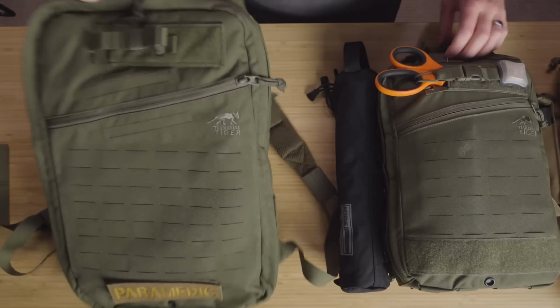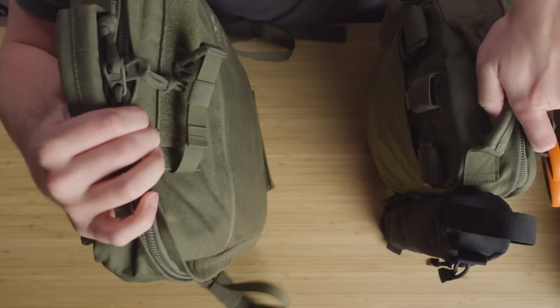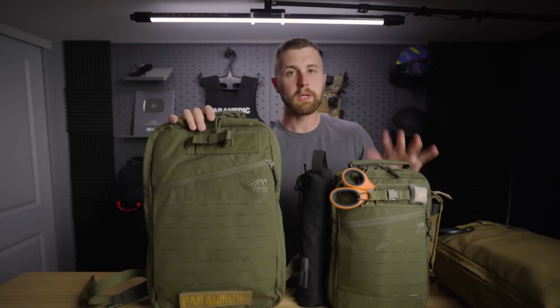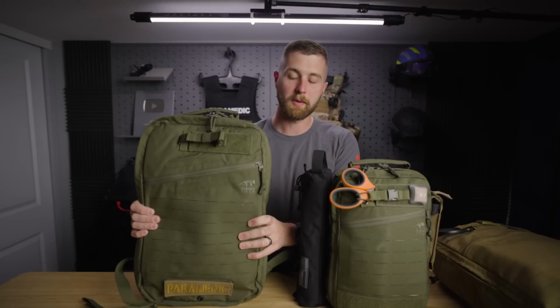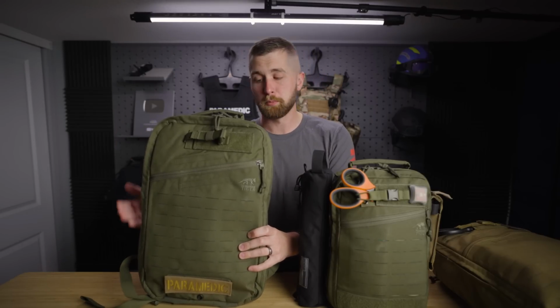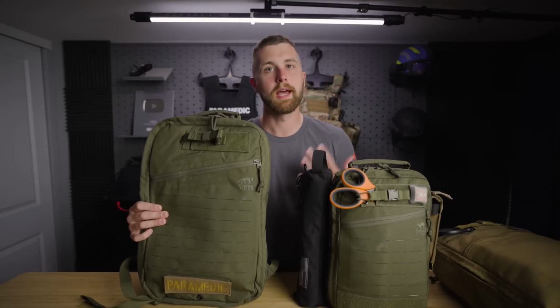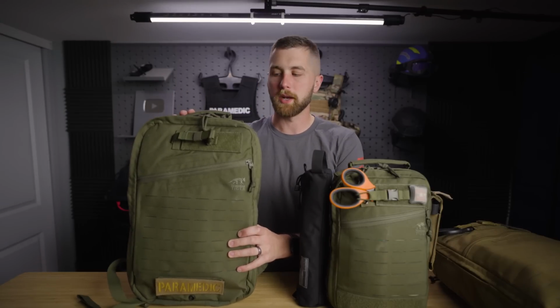This right here is the Tasmanian Tiger regular. It's just kind of their standard version. Looks very similar to the small. It's just a bigger form factor. Be warned, I got this pack thinking that I was going to use this to replace my NAR4 aid bag, and it's quite a bit smaller. So I ended up actually having to move to the large to fit everything I needed as an ALS SWAT provider. Just know that it's not quite as big.